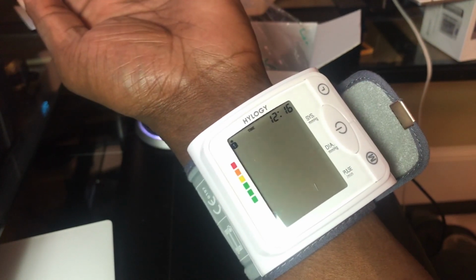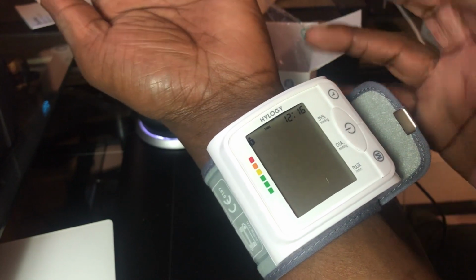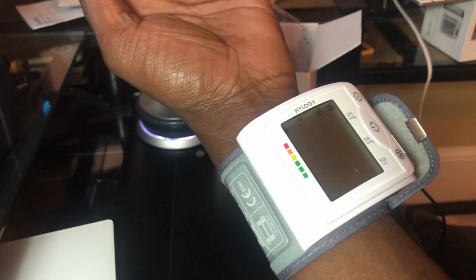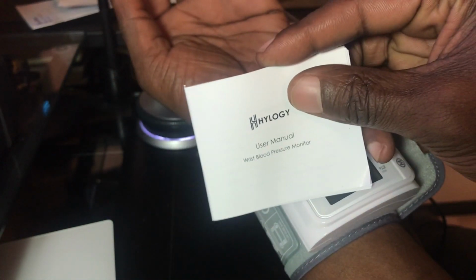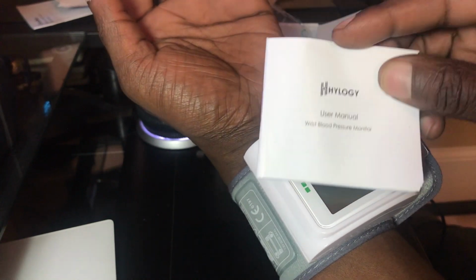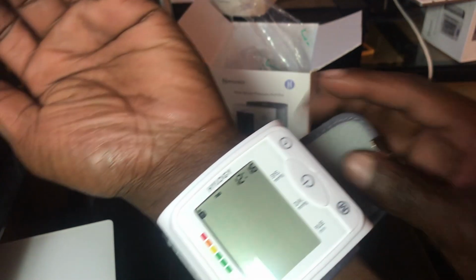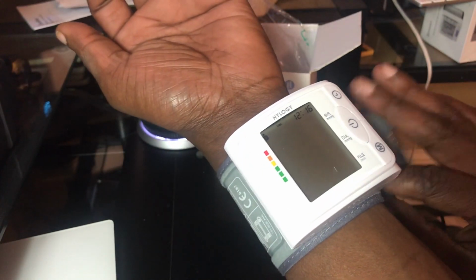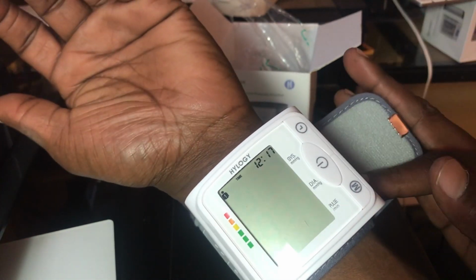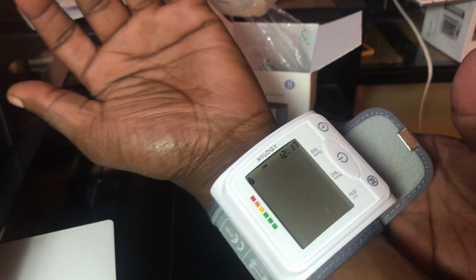Alright, so I think that's pretty much all there is to it. It's a pretty easy gadget to use, but I recommend you go through the user manual because it's got the error messages that might pop up, and it's good that you become familiar with what's going on with the gadget, especially when it comes to the strap. I think that's the most important part, because if it's too loose, then it won't give you a good reading. If it's too tight, it also won't give you a good reading.